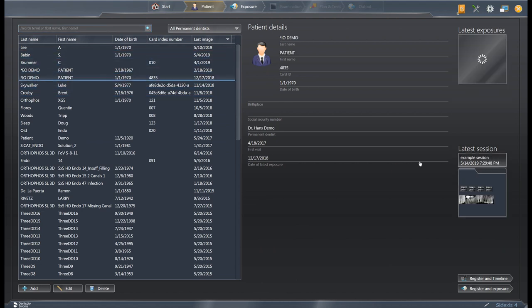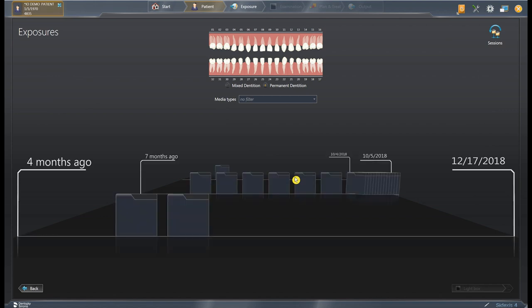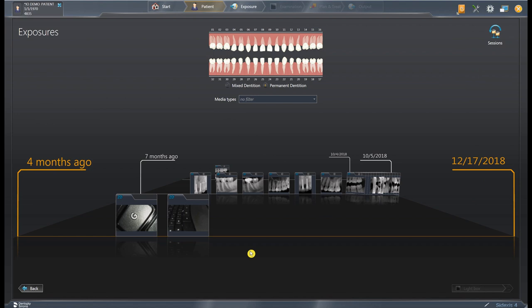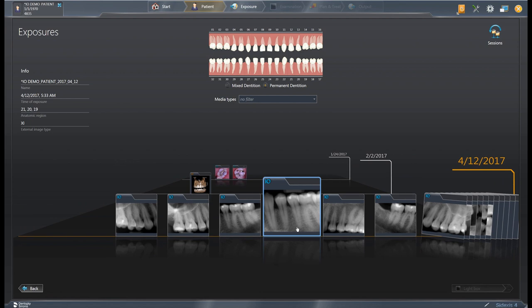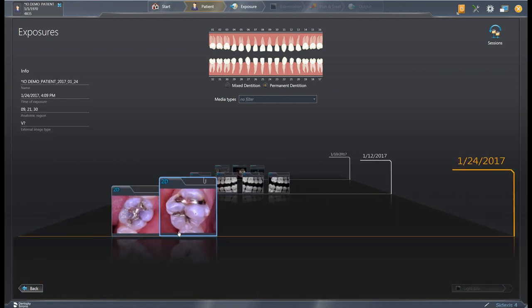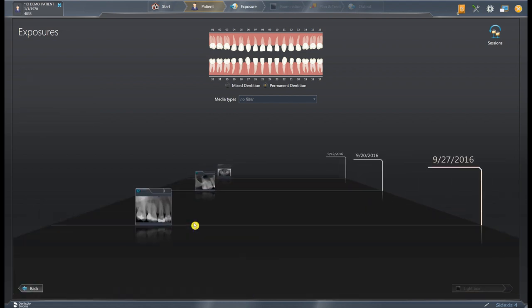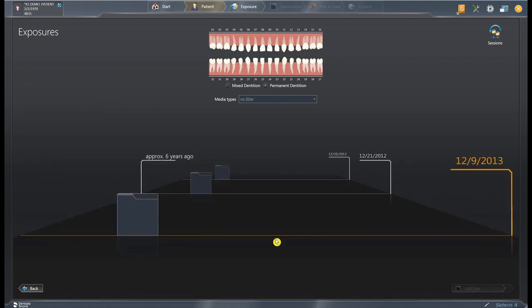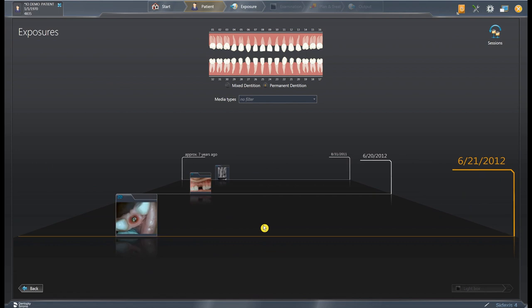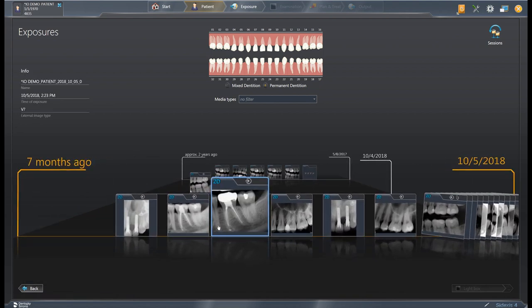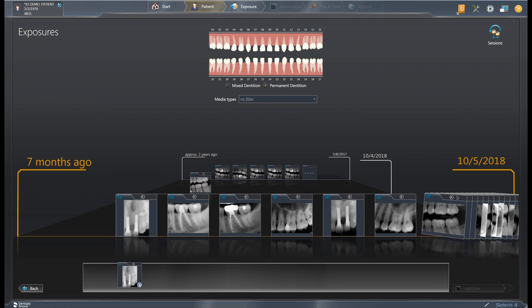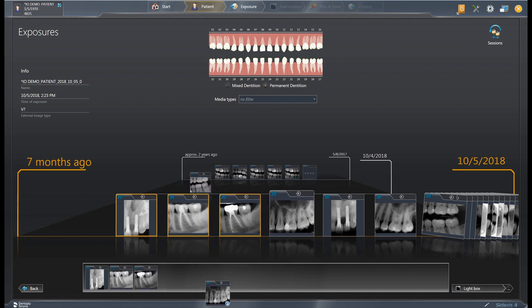I'm going to access the light box through our timeline — but let me show you a little bit about the timeline first. This is where we chronologically store all of your patient's images: we can have sensor images, 3D volumes, intraoral camera shots, all different types of images — pans, cephs — everything can be stored here. You can click and hold and pull images down into the active area at the bottom.